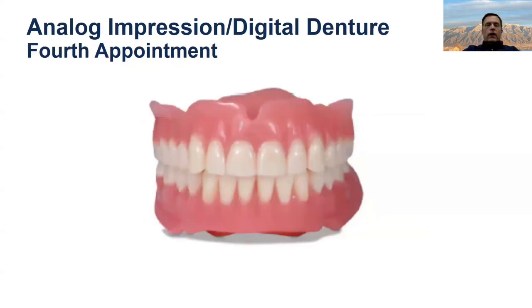So once any changes have been made to the design, your laboratory will scan in additional data if necessary and go ahead and finish the design. Laboratories are doing three main workflows today. One is milling the denture. It gets a nice result, but it takes a long time in the laboratory and it's kind of hard on the equipment. So you're not seeing as many people doing that today.